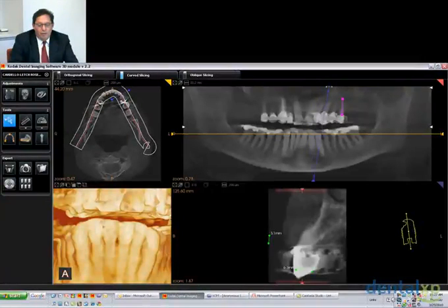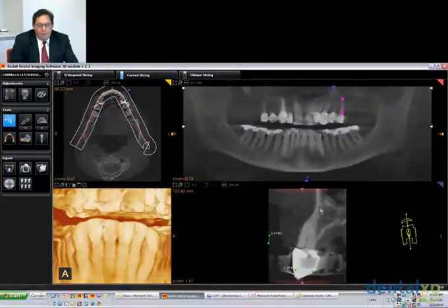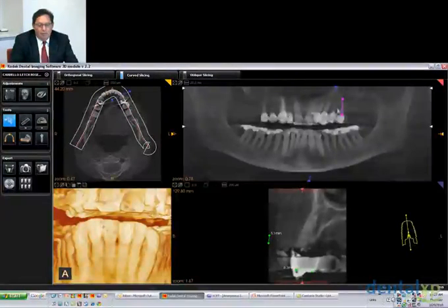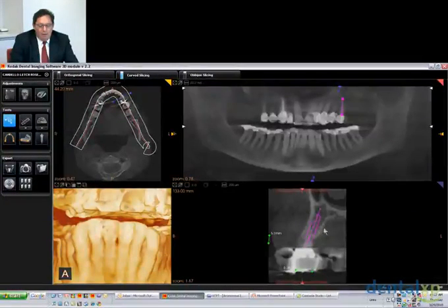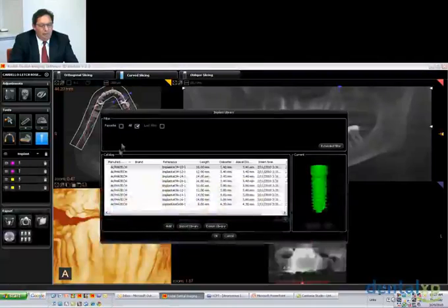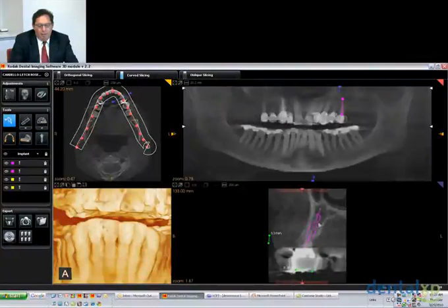So, for instance, here, when I place in the software, you can actually place the implant and plan for it. So here, I'll show you an implant. I'm going to show it to you in a second. So here's an implant coming into view, and it was planned through the implant section of their software. And for me, it's very uncomplicated. I go right to my favorite. We've placed Zimmer implants here and went right to it, and very quickly placed these implants in.